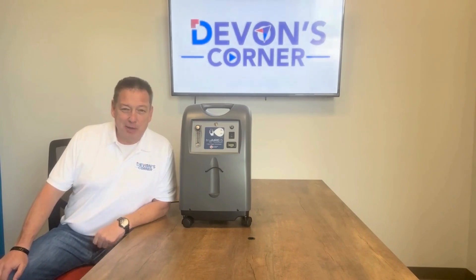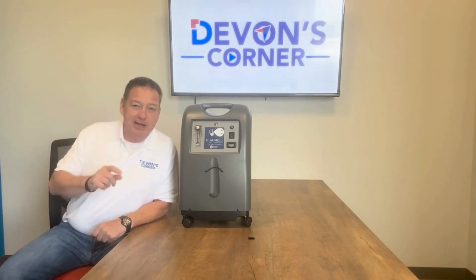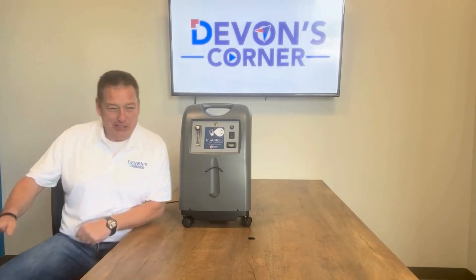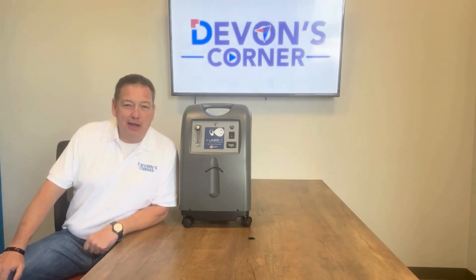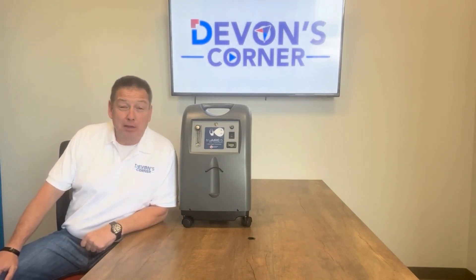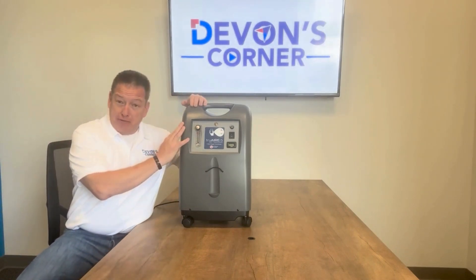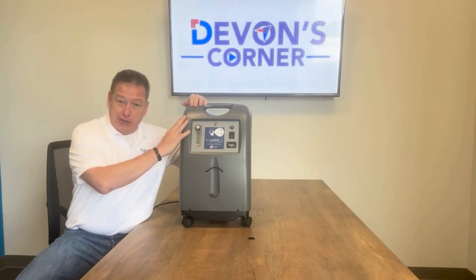Hey guys, Devin Drysdale with Compass Health Brands. On today's Devon's Corner, I would like to talk about efficiency and value of your time regarding the Roscoe Medical truAIRE-5, 5-liter stationary concentrator.